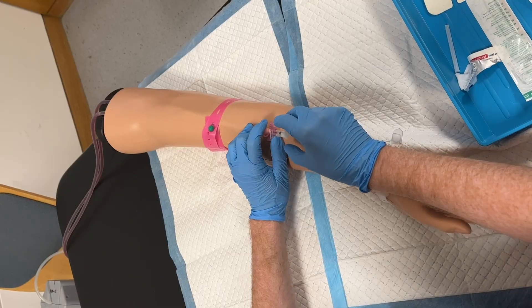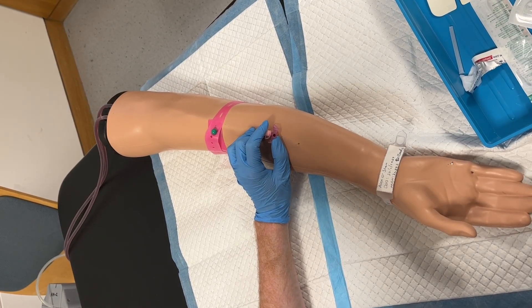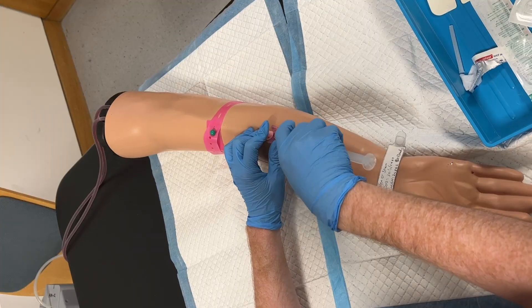If you wish to avoid bleeding from the cannula as you remove the needle and apply the bung, a small square of gauze can be placed under the cannula.